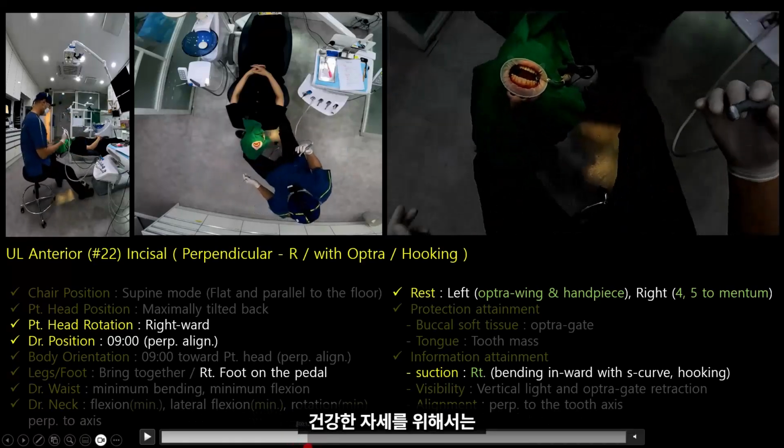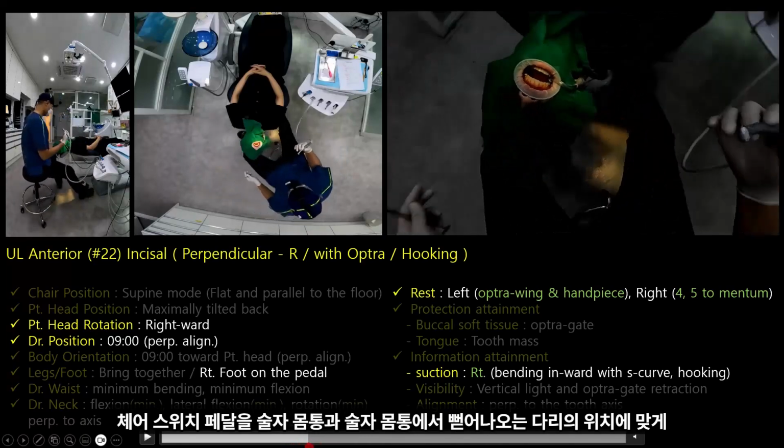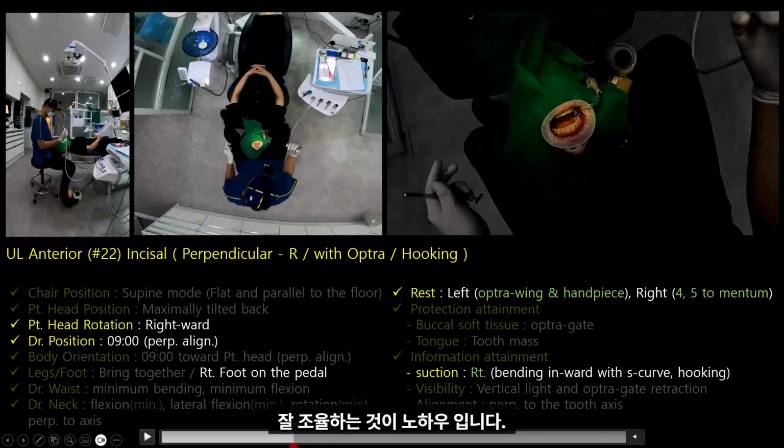For maintaining a healthy posture, a crucial technique is to effectively adjust the chair switch pedal. This should align with the operator's torso and the position of the leg that extends from the operator's body.